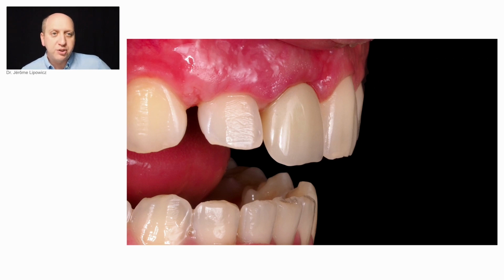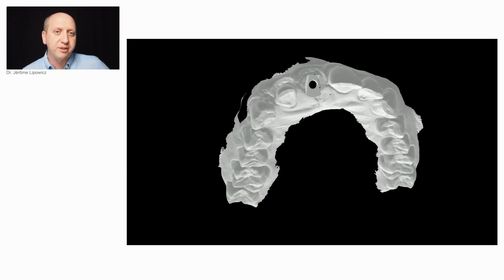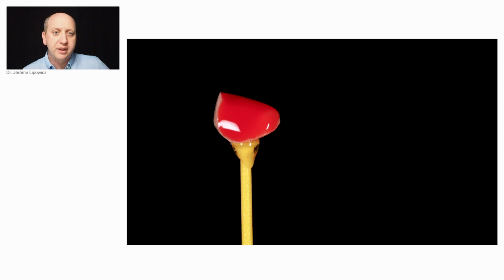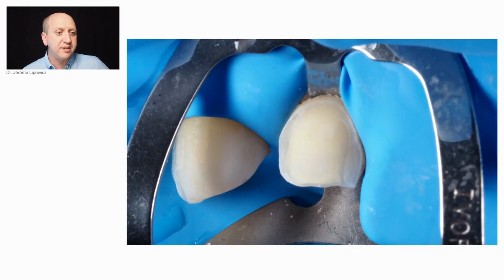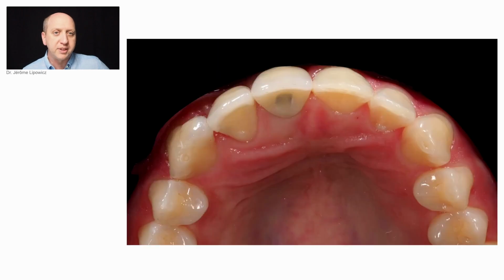Of course, that didn't solve the issue with the tooth number 12, so orthodontic aligners couldn't correctly fix it either, so we decided to go with veneers. And after that, we have a nice aesthetic outcome for these patients.